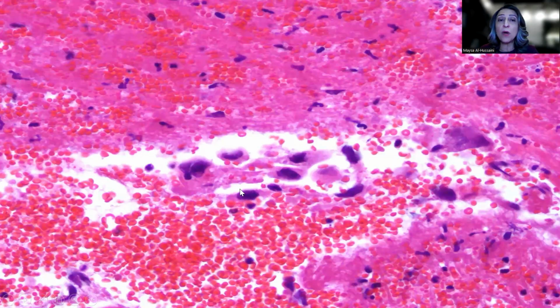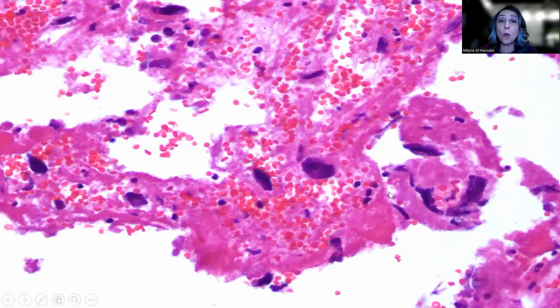However, other fragments were composed of only blood clot-like tissue, lots of hemorrhage and necrosis, but this was punctuated by some of those cells, which on higher power magnification were really large cells with hyperchromatic nuclei, sometimes multiple nucleoli, in a way that should make you suspicious of syncytiotrophoblasts or a choriocarcinoma component.